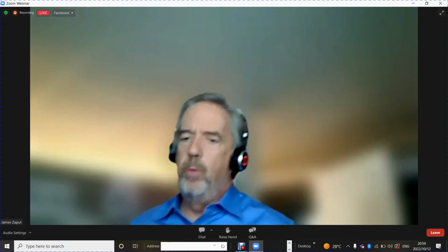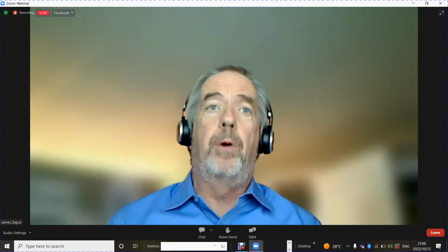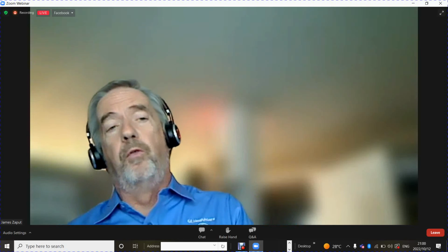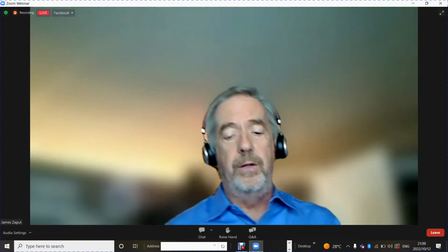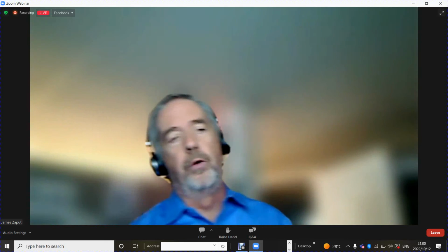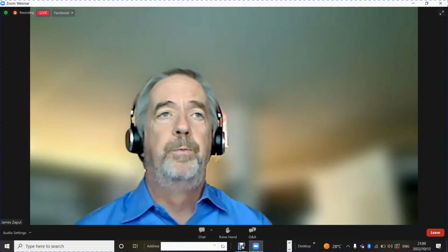Yeah, every one of us as an OEM, we document an introduction to our product. It's called a pre-installation manual, things a facility would need to concern themselves with before considering siting our product. That would be the first place to start. They're all in a logical order: major infrastructure, minor infrastructure, delivery routes. All of those requirements are in the pre-installation guide, and we all publish them.